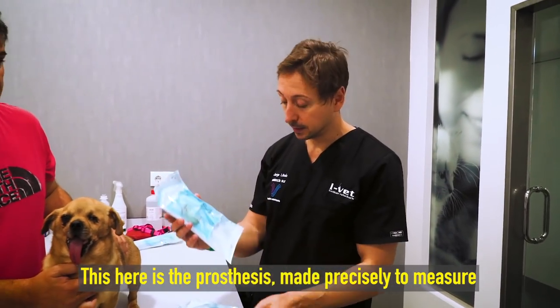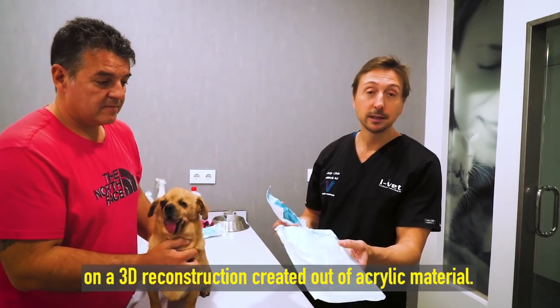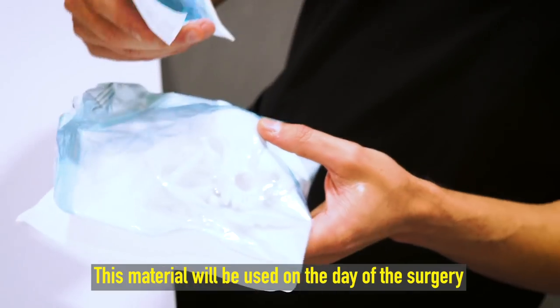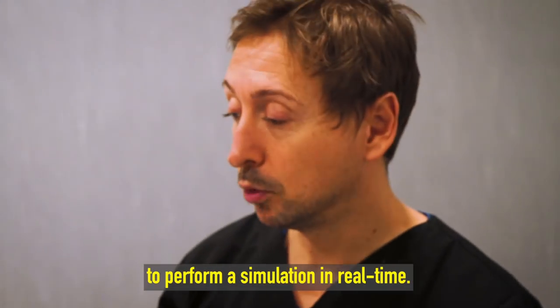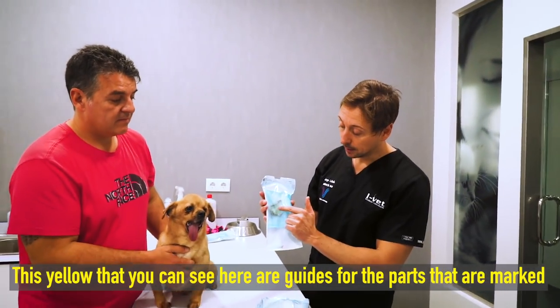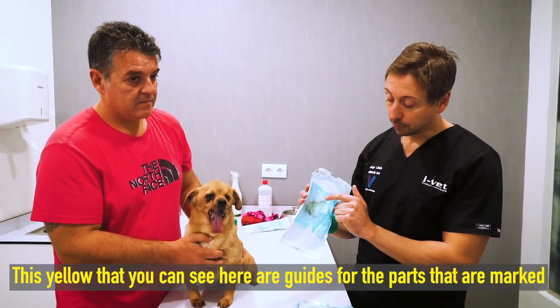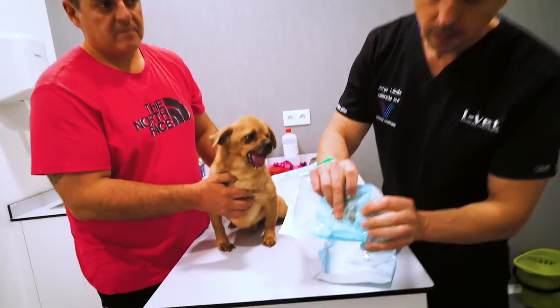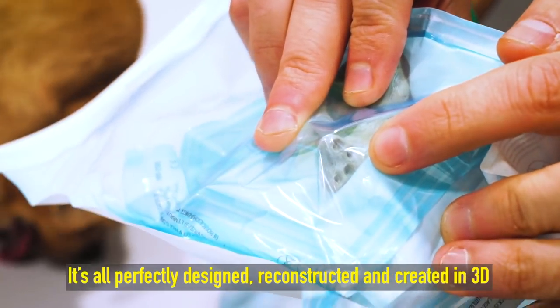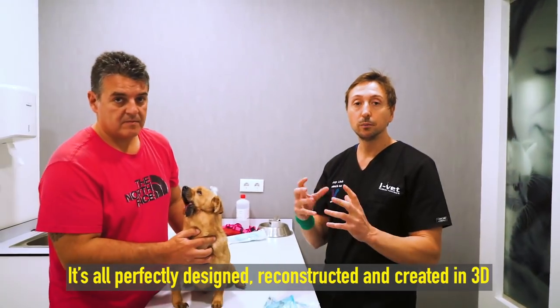Esta es la prótesis hecha a medida exacta sobre una reconstrucción de material acrílico en 3D. Este modelo físico lo vamos a utilizar el día de la operación para poder hacer una simulación en tiempo real. Lo que veis aquí en amarillo son unas guías para las zonas marcadas — veis aquí los agujeritos por donde irán los tornillos.